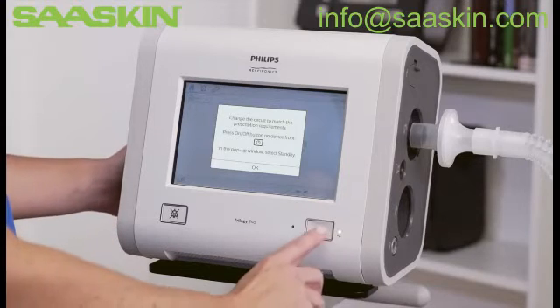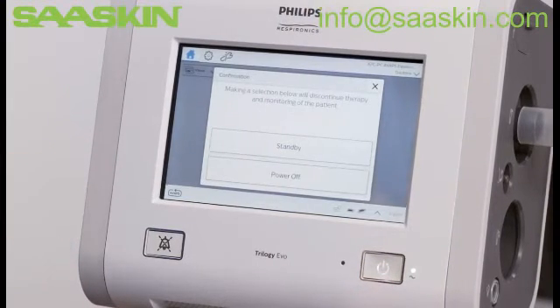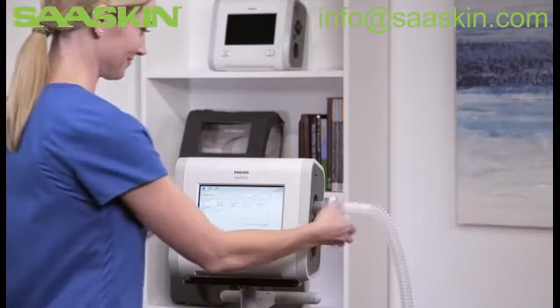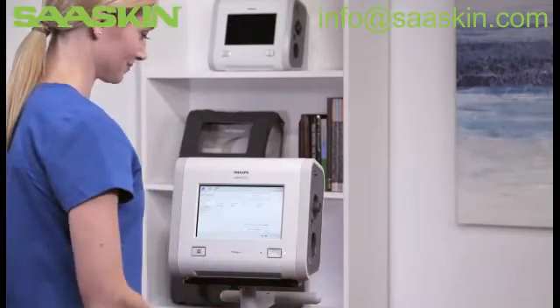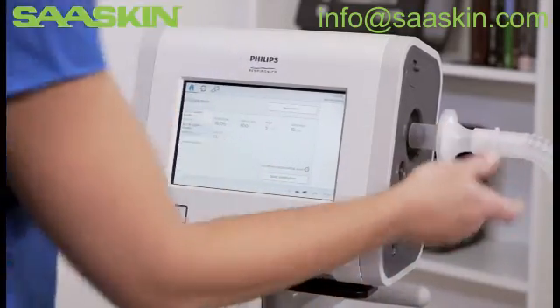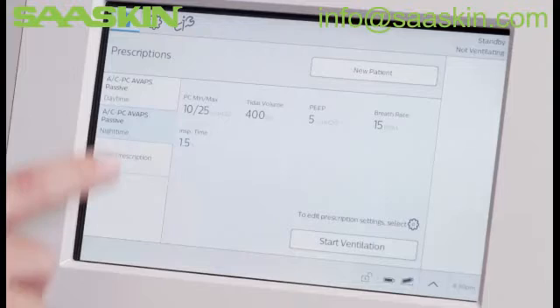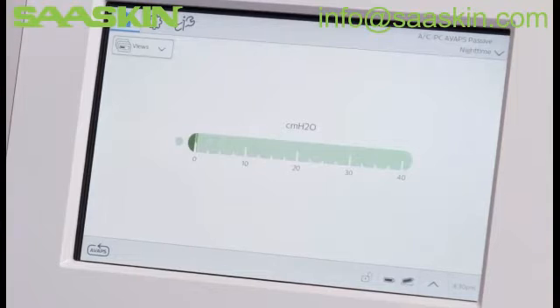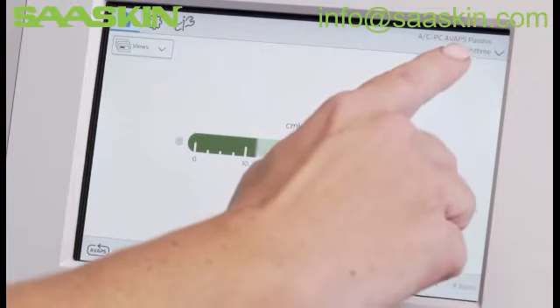Follow the instructions to place ventilation in standby by pressing the on-off button on the front panel. Change the circuit, and select the appropriate prescription from the home window and press Start Ventilation. We are now ventilating with a nighttime prescription.